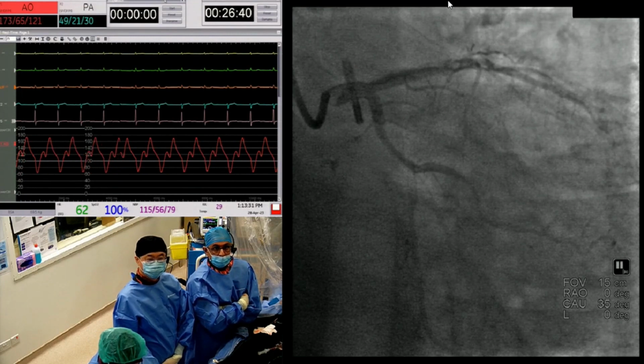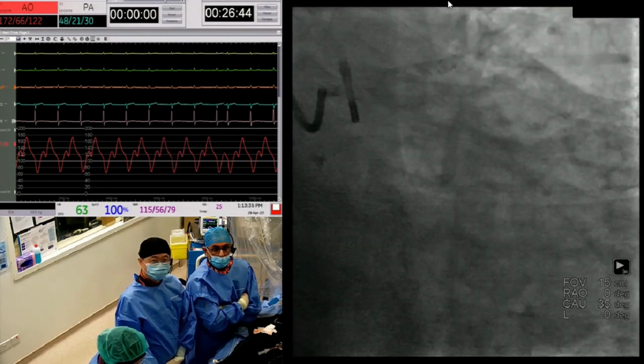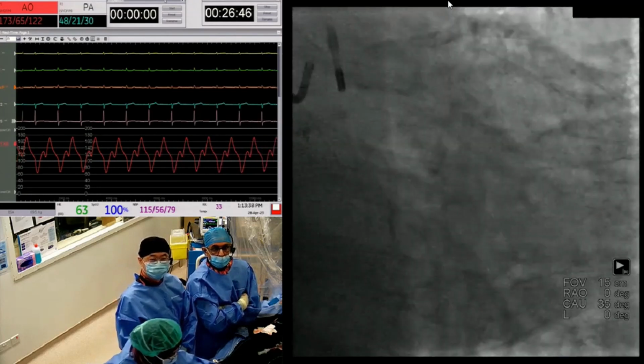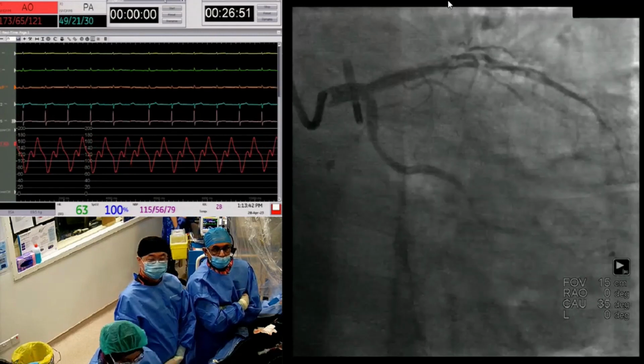Till they come on, Dr. Harun Babar, if you were coming to left main, then definitely Megatron or something else would have been better. But this was not my point. If you are coming to left main, then it should be, because it's a big left main. Yeah, but he didn't come to the left main, so that's why.